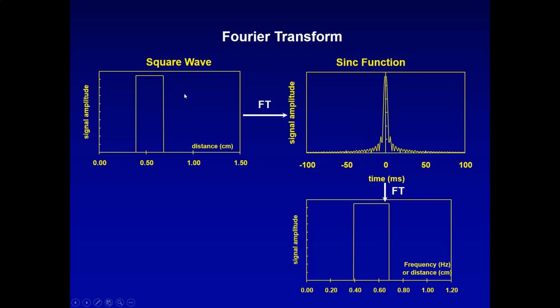The big thing in the middle represents the size of the box, mostly where nothing much is happening. So in this picture, there's nothing much happening here or here. The box itself has a long flat place up at the top. So if we're talking about spatial frequencies, there's no oscillations per centimeter of this object. It's just flat. It has zero frequency.